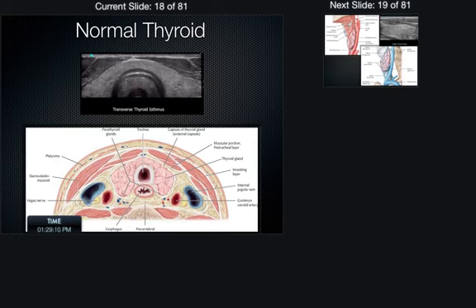So keep that in mind today. I mean, this glandular tissue has this sort of appearance to it. And we can see the trachea. That's this hyperechoic structure right here, and then this is just some artifact seen down here, some reflection artifact of the thyroid that's above the trachea when the trachea is air-filled in this particular axis. So that's a short axis view. We can see the left thyroid here, the isthmus, and then over here the right thyroid.